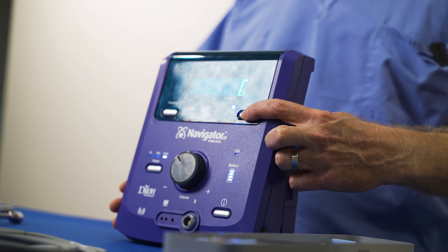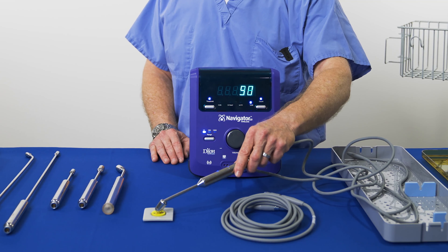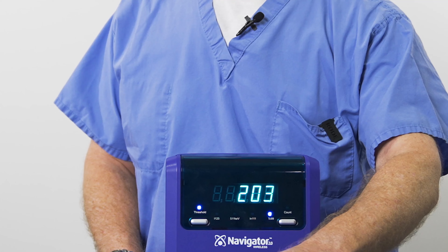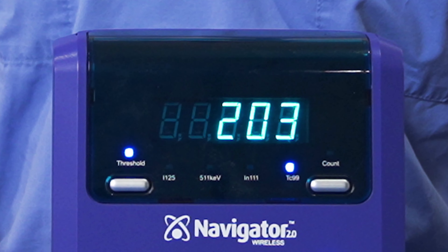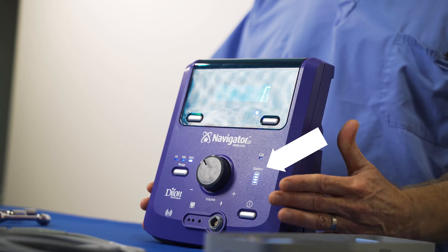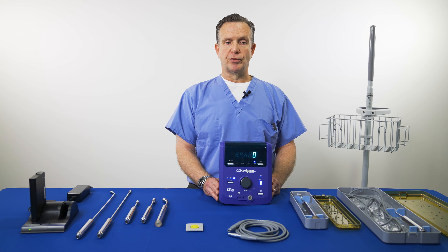When the count button has been pressed and released, the count indicator on the display screen is illuminated and the display will show the increasing counts. The probe must be held in a fixed position for the entire duration of the ten-second count. When the ten seconds are complete, the control unit beeps and the total count is shown on the display. There is a battery indicator light to indicate the battery life for the control unit. When the light indicates the battery is at 25% charge, the battery should be immediately replaced and recharged.